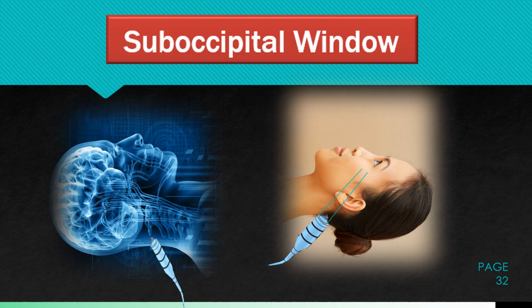Our probe placement is shown here. So you will have your patient supine with the head rotated slightly and the probe just underneath the skull. You can feel with your fingers where the skull ends before you place that probe to help you find that window easier. So you'll slide that probe underneath the base of the skull and you'll angle it up towards the eyes or the nose, depending on the patient's anatomy. You will first isolate your vertebral artery, and then you'll continue on to your basilar artery.